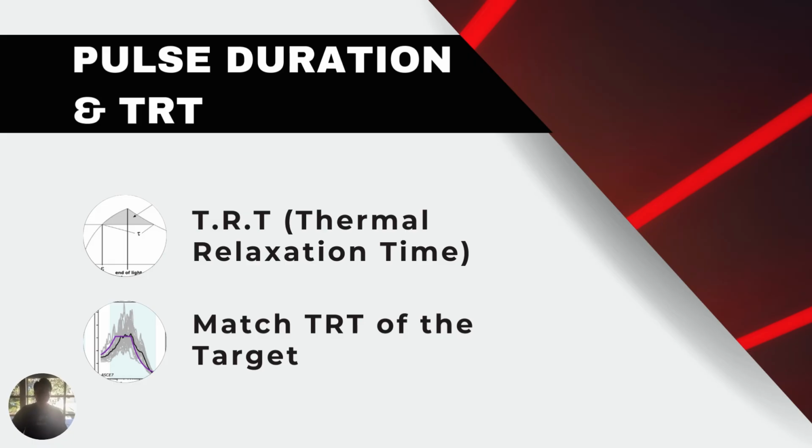The importance of pulse timing and duration is very important, especially when you're treating your patients or your target. You have to know your TRT, which is your thermal relaxation time, which means the time when your structure cools down enough that it doesn't get injured. So the goal is to match the TRT of your target.